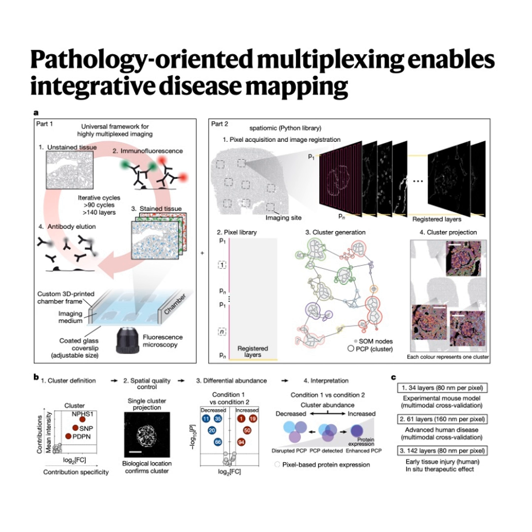The analysis showed that one of the top contributing proteins to cluster 21 was PJUN. That's the phosphorylated or active form of the JUN protein, which is part of the AP1 transcription factor complex involved in stress responses and cell proliferation. Okay, so an active stress proliferation signal. But where was this signal happening? That's the key PathoPlex advantage, right? The location. Precisely. The high-resolution mapping showed cluster 21 wasn't just everywhere. It was primarily located in two specific cell types, the kidney tubule cells and, crucially, the parietal epithelial cells, or PECs.